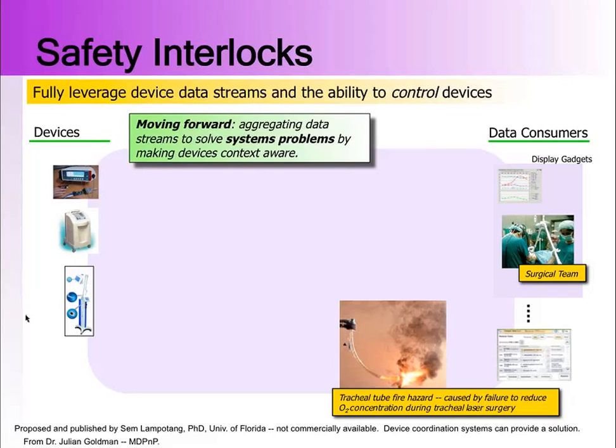And so if you Google tracheal tube fire hazard, you'll actually get pictures like this, and even pictures where patients' faces have been burned. And the article that I've quoted at the bottom of this slide here indicates that around 1 out of every 100 operations like this results in some type of fire situation.